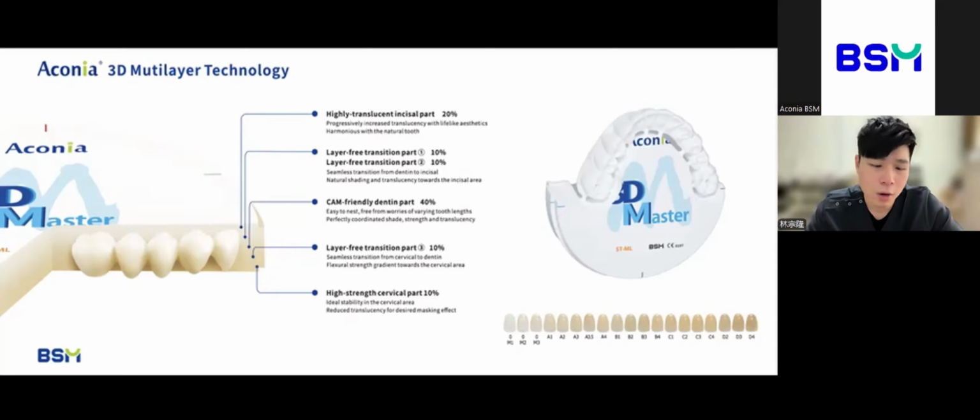Even if you only have A2 or A3, you can still get all 16 shade guide colors just with external stain. This is especially useful for posterior cases where the color is simple. It really makes the workflow faster. And this was very hard to do in the past. So we can really thank material science for making this possible.